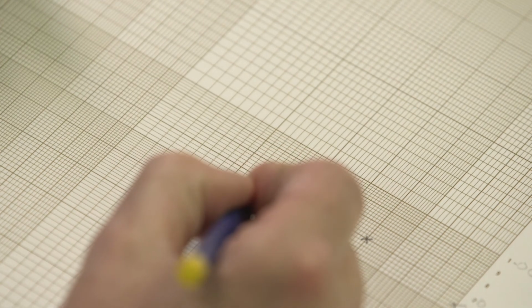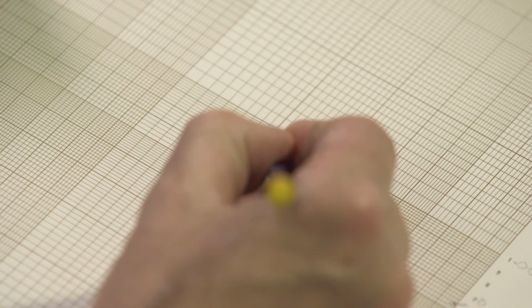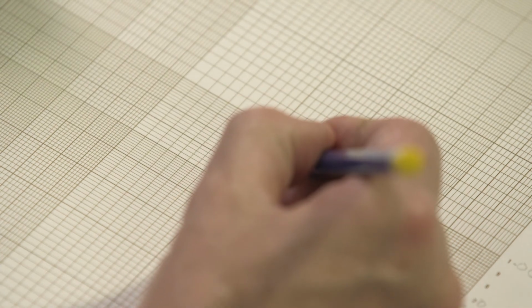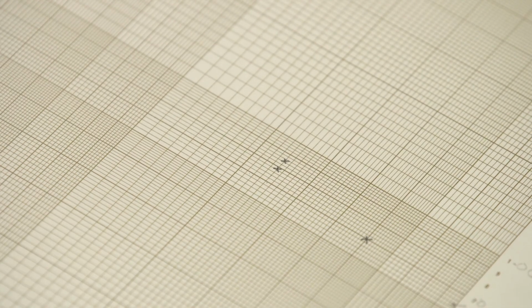So at this point, we have to ask the question, is one affected by some pipetting error, by a technical error during the test? So I want to look at both of those times to see where they sit on the graph paper. This is the 1 in 40 dilution, 25%, 78.5 seconds. So 70, 72, 74, 76, 78.5 could be here. On the other hand, the other 1 in 40 clotting time, 85 seconds. 80, 82, 84, 85. So we have a decision to make.